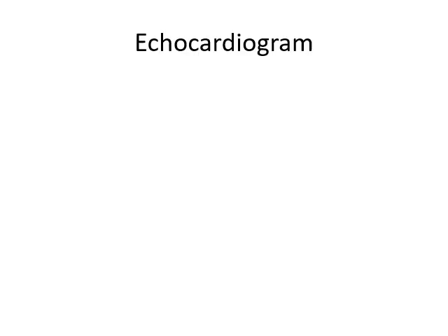Anyway. So one of the last things we're going to talk about now is an echocardiogram. So if you ever get sent for an echocardiogram, what an echocardiogram is basically an ultrasound of the heart. So a lot of times, if you're going in for surgery or chemotherapy or just general health, sometimes they'll send you in for an echocardiogram just to see how healthy your heart is, all right?